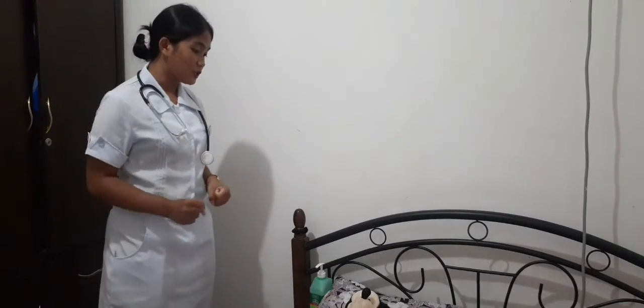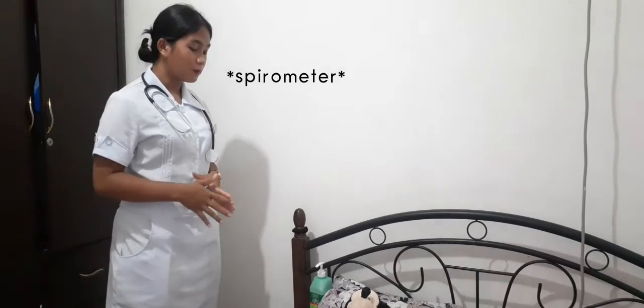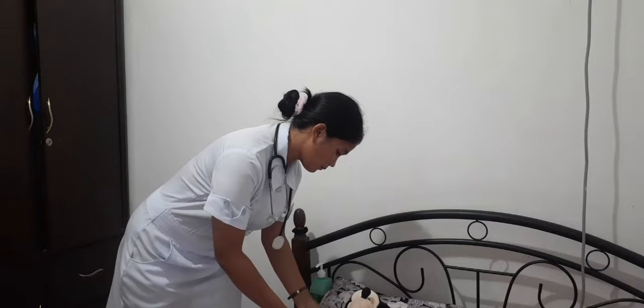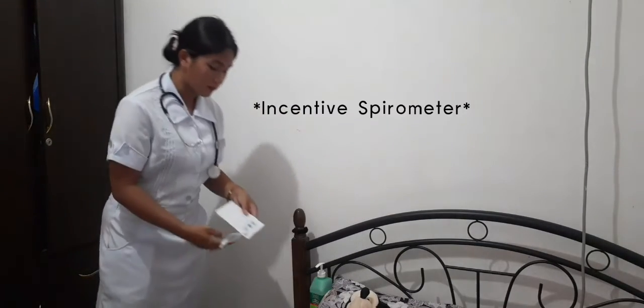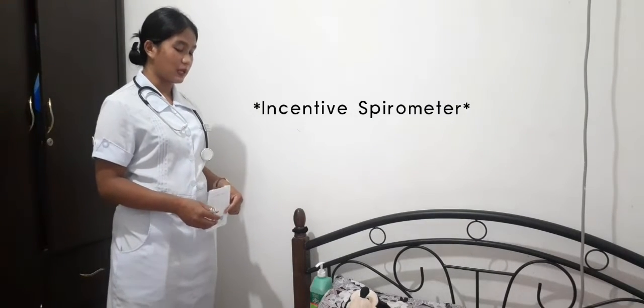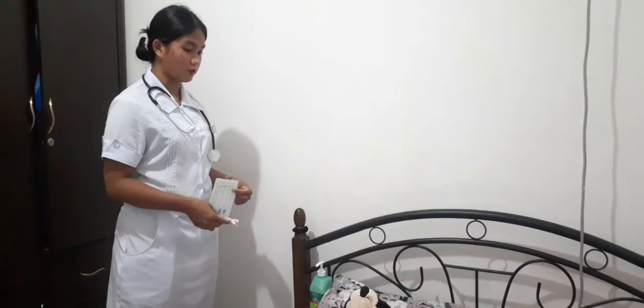So, hi ma'am, I am Nurse Sheila. I will be your nursing assistant for today. So, there's an order for you for an incentive spirometry. But before we proceed, can you please state your full name and birthday? Okay, thank you. So, today, we're going to use this device called incentive spirometry. So this device will be a great help for you to improve your breathing and to lessen your respiratory secretions. So this can be a bit painful, but don't worry, I am here to guide you. And remember that we did this before your operation, right?